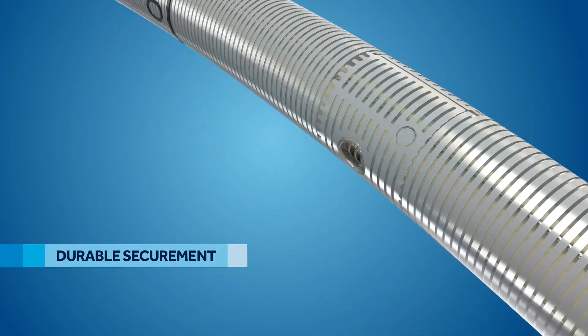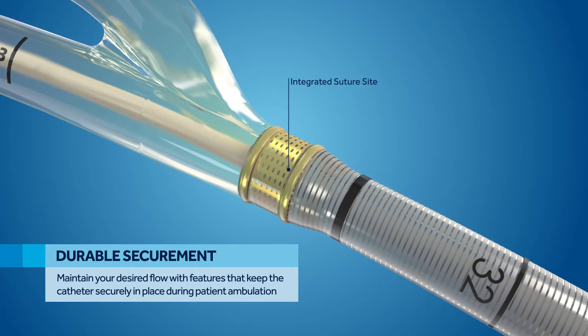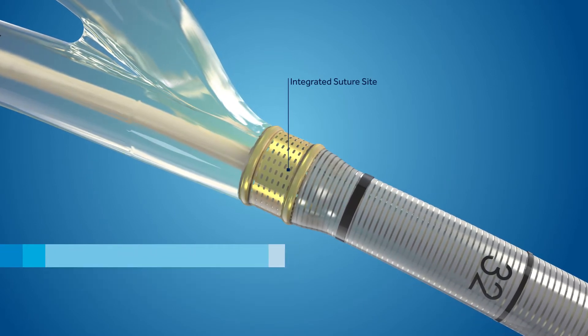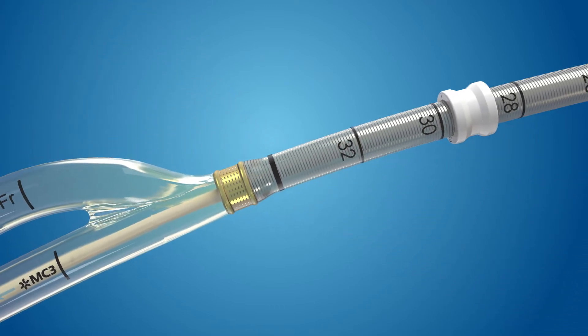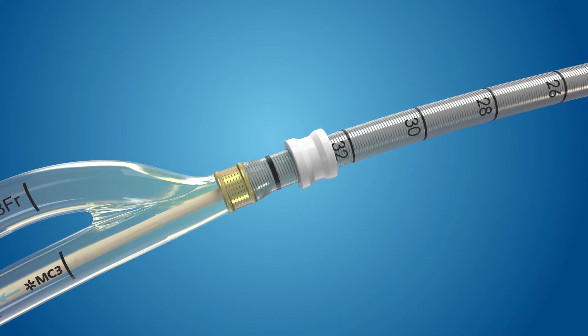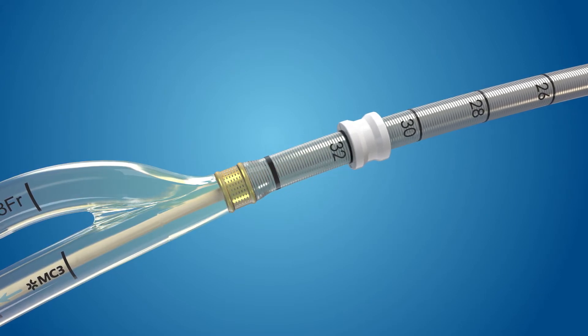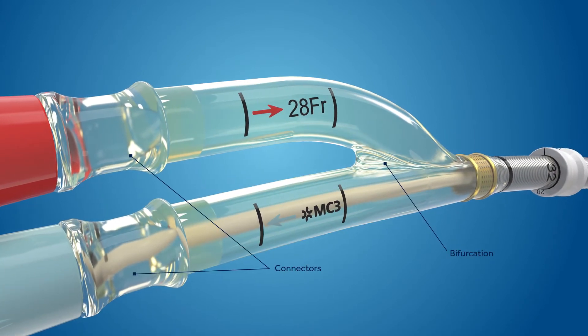Durable securement is achieved by suturing directly on the Gold Integrated Suture Site, which contains special reinforcement to protect against catheter damage. An optional suture collar can be placed at a desired location on the catheter body before or after insertion. Sutures can also be used around the bifurcation or on the connectors as needed.